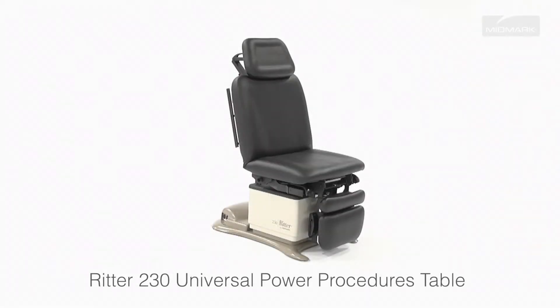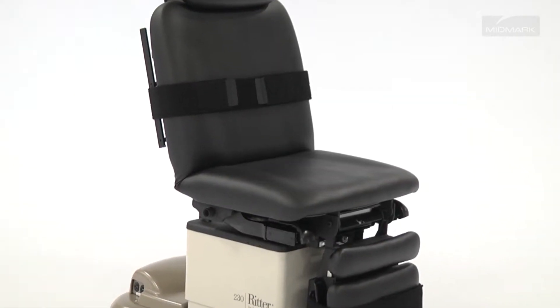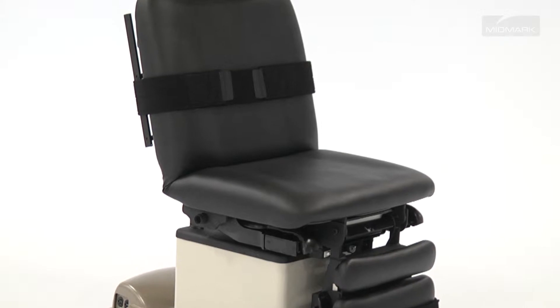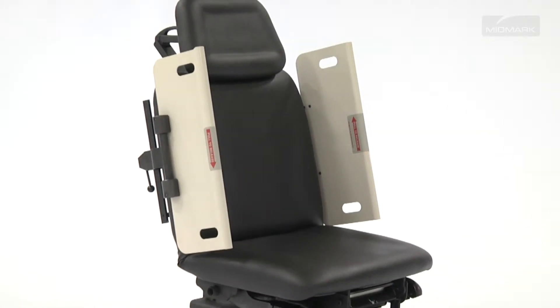The Ritter 230 Universal Power Procedures Table is designed to be easily enhanced with a variety of accessories to fit your patient's and practice's specific needs. For procedures that require added patient security, your table can be equipped with either Security Straps or Security Side Panels, depending on the needs of the procedure.